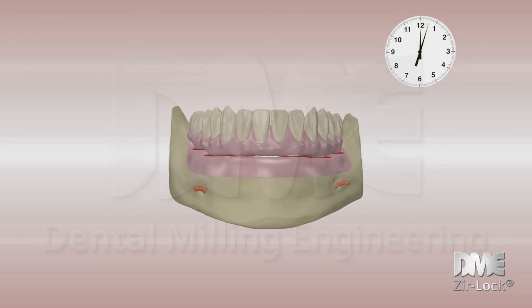if necessary. It is very important and advisable, when placing the cement into the prosthesis, not to fill the cavities to the maximum, because when the titanium retainer holder occupies the cavity, the entire surplus cement will go outside the cavity of the prosthesis, even invading tissues.